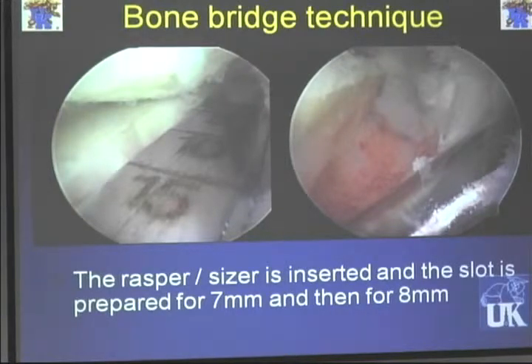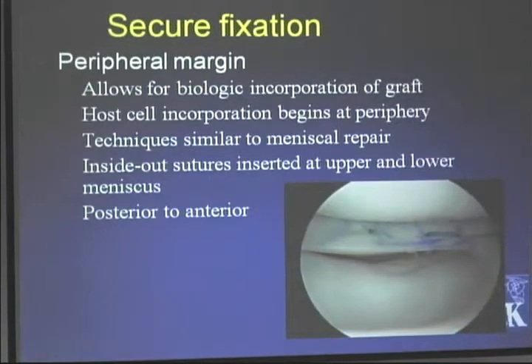If you don't go far enough because you're gun shy, then your lateral meniscus is not going to be in far enough, and you're going to get recurrent bucket handle tears of the posterior horn of your lateral meniscus. I have had a patient referred to me for that where the previous surgeon was not far enough posterior, I would imagine because of being a little gun shy. So if you're not sure, bring a mini C-arm into the room and check it radiographically. Almost all ORs now have a mini C-arm in place to do that.